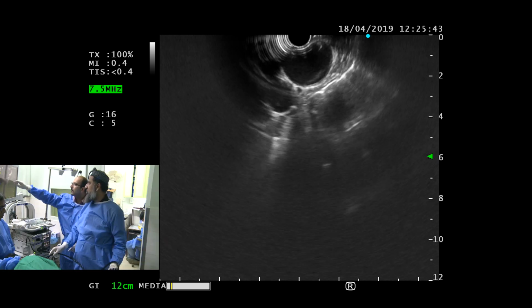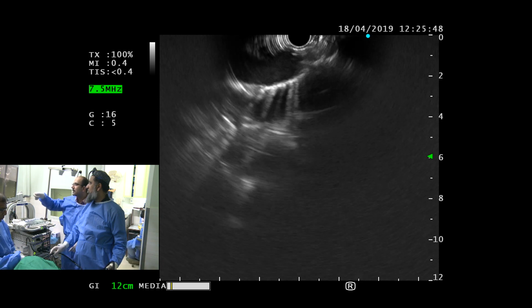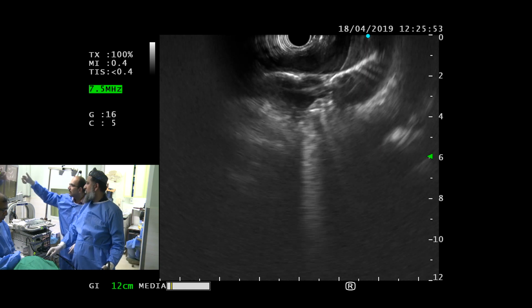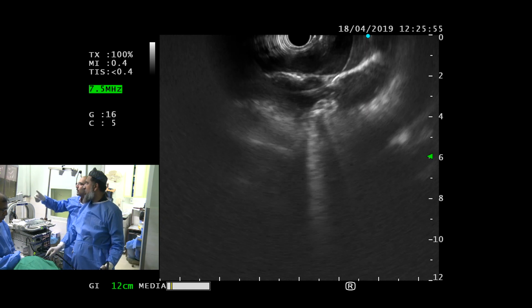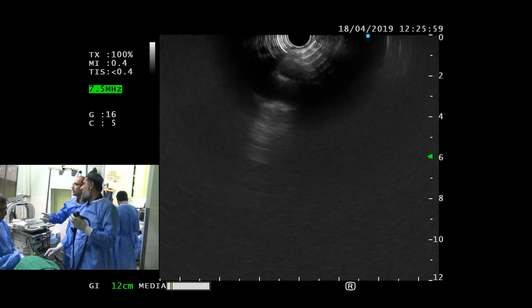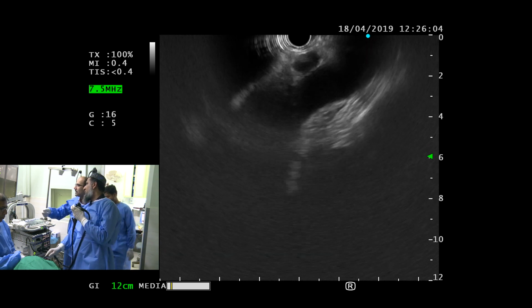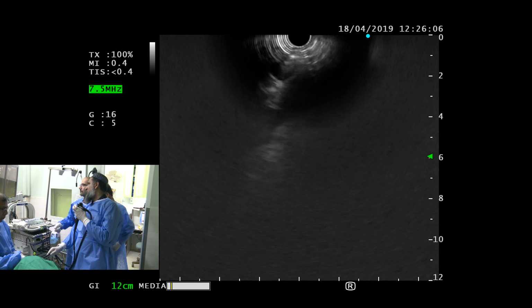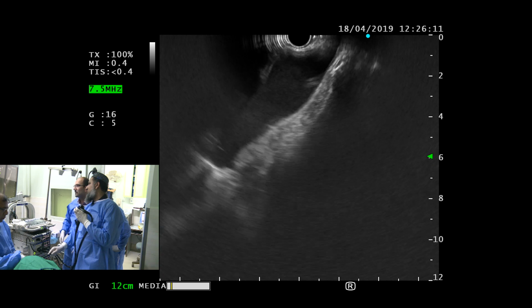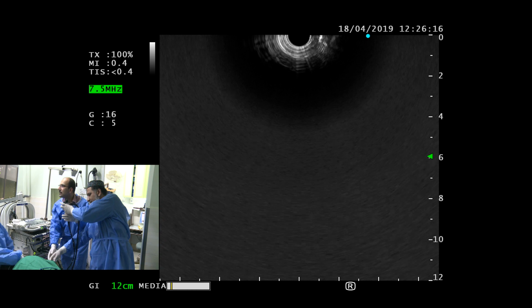Now stop. Now thumb towards you. Advance a tiny bit so you push this in. Now that's it. Now thumb towards you and go clockwise. Thumb towards you more. And pull back a tiny bit as you go clockwise. Thumb down towards you. Thumb is towards me. Okay, let me show you. I would do it.